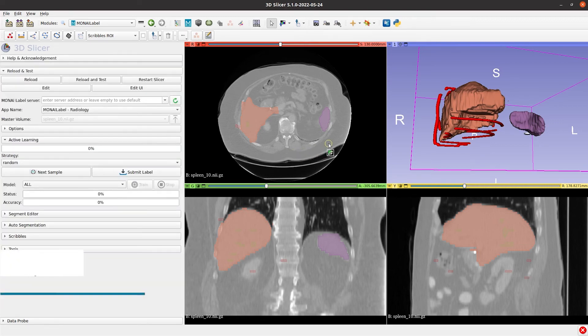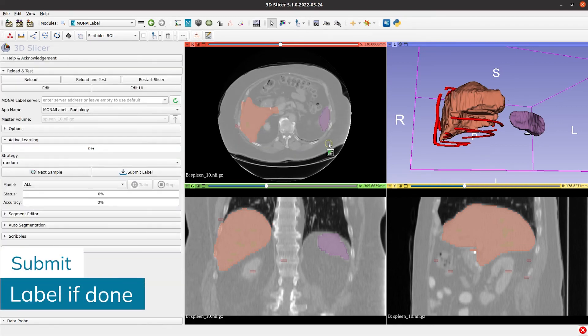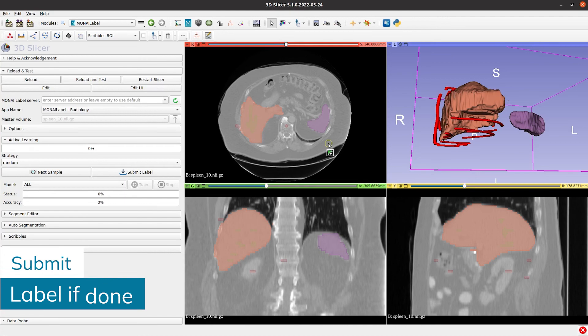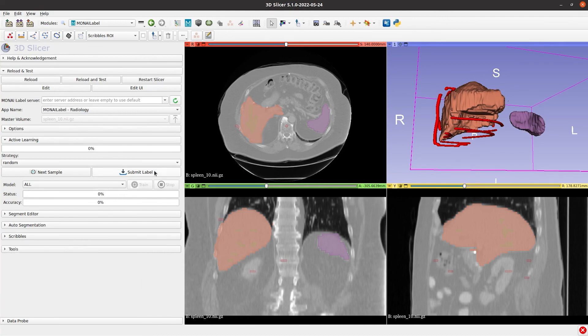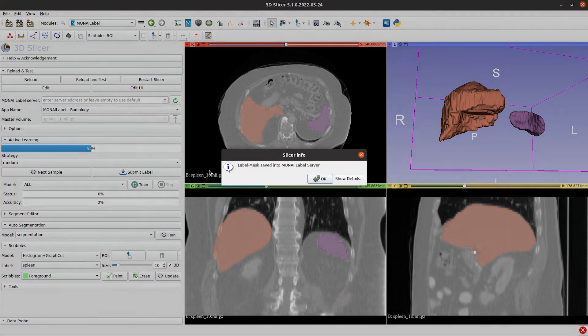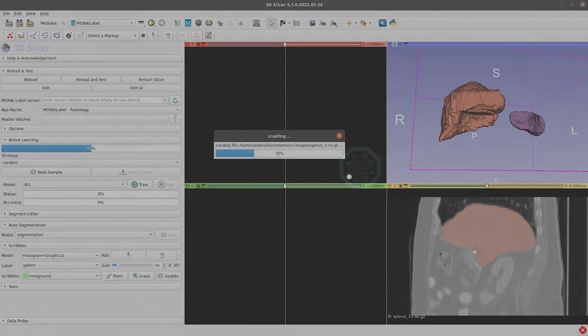If you think that the label is ready, we can submit them now to the server. That's all for this video. See you at the next one.